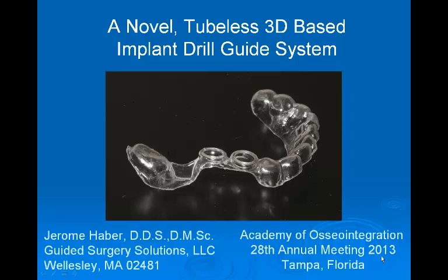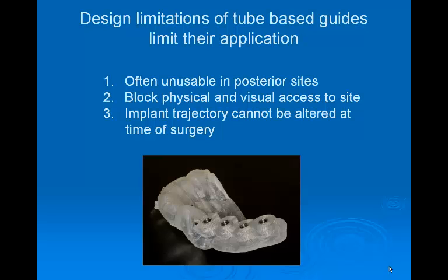Drill guides based on 3D images and virtual plans have been used in implant dentistry for 2 decades. All commercial guides share a similar design, employing a guide tube to transfer the drill trajectory from the surgical plan to the patient. While tube guides work well in many cases, their design confers limitations which restrict their use.